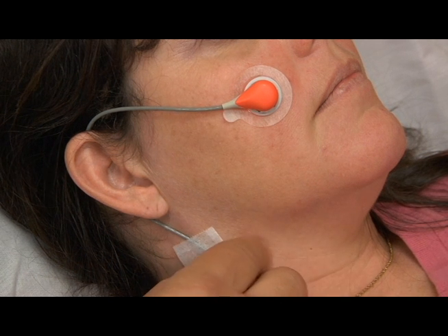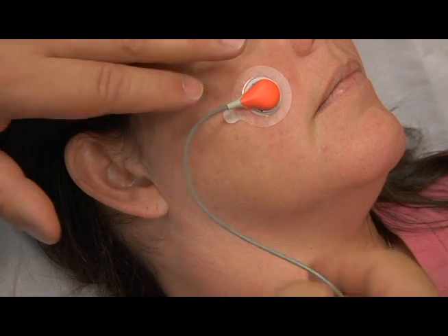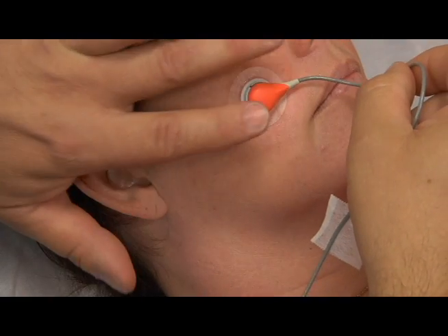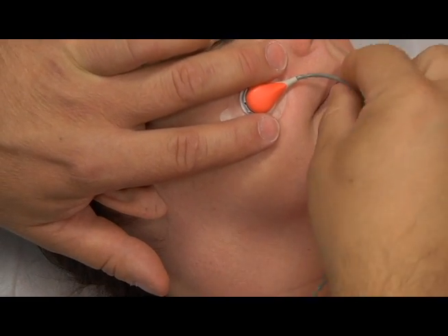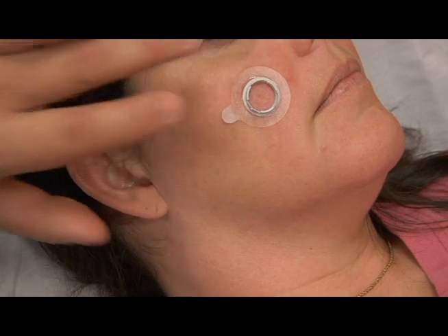Multi-Site Ring: Remove the adhesive tape from the sensor cable. Place a finger on either side of the sensor and rotate the sensor towards the index finger. As the strain relief of the sensor cable comes in contact with the fingernail on the index finger, continue turning and the sensor will be wedged from its seat as shown.